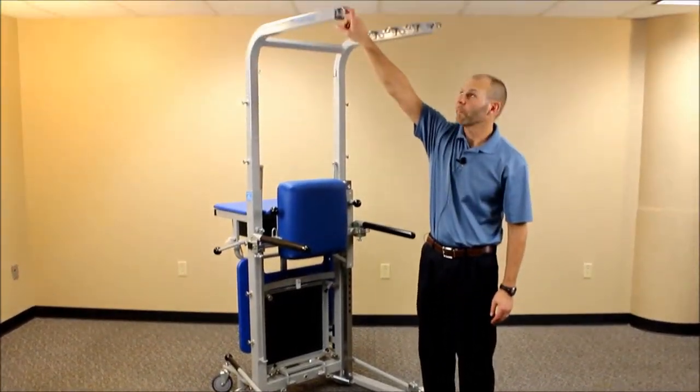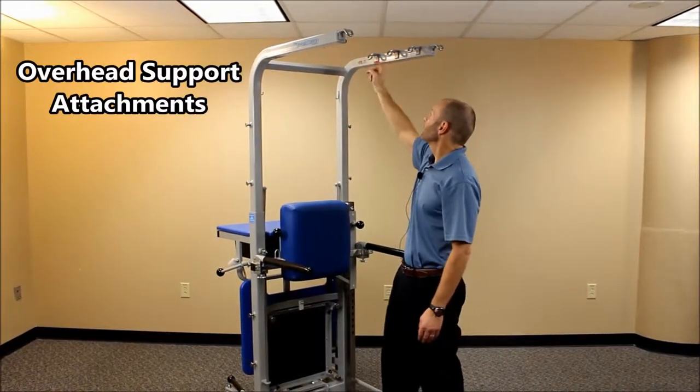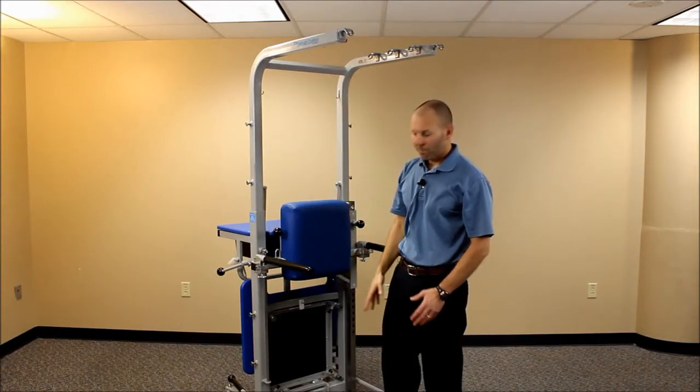We also have the upper support pieces here that have various attachment points, which we'll cover in a future video — how to utilize those for clipping on accessories or the harness that is used for safety support.